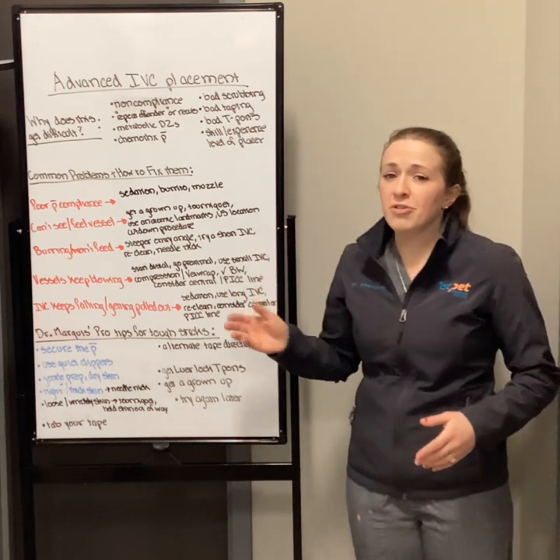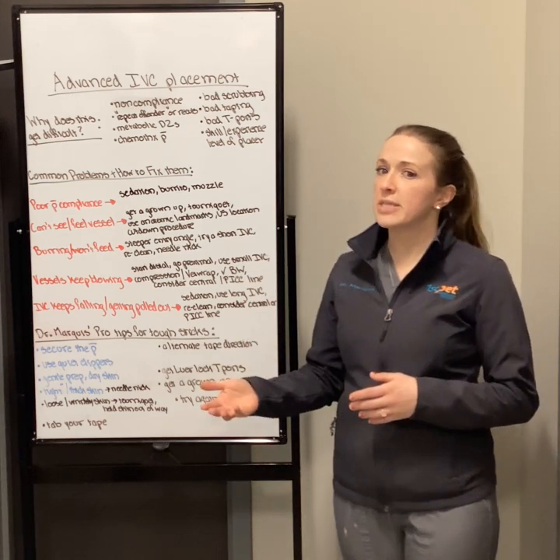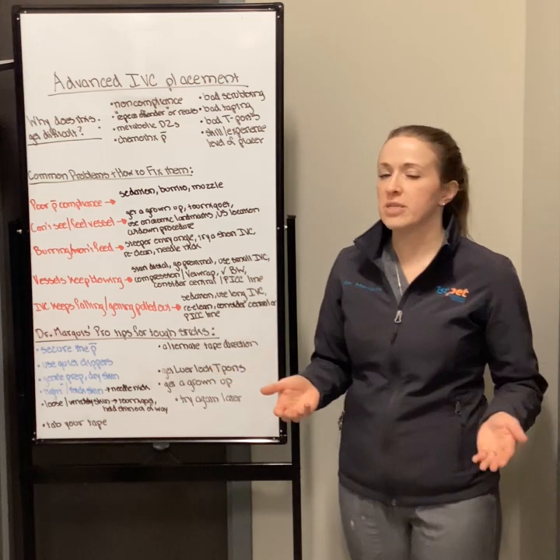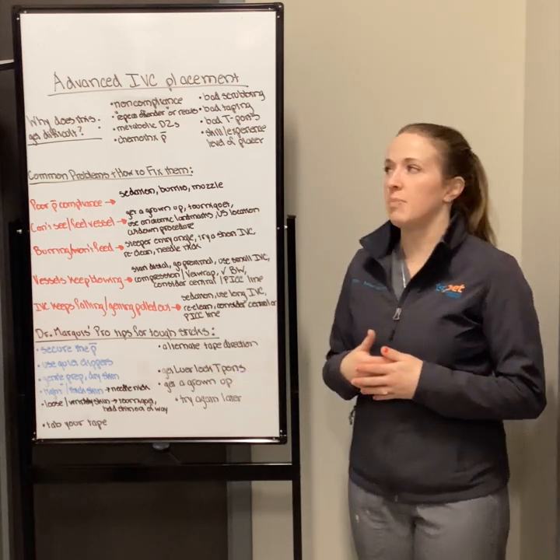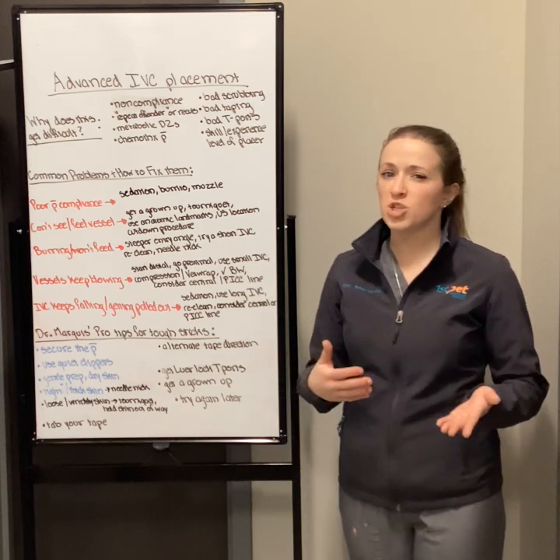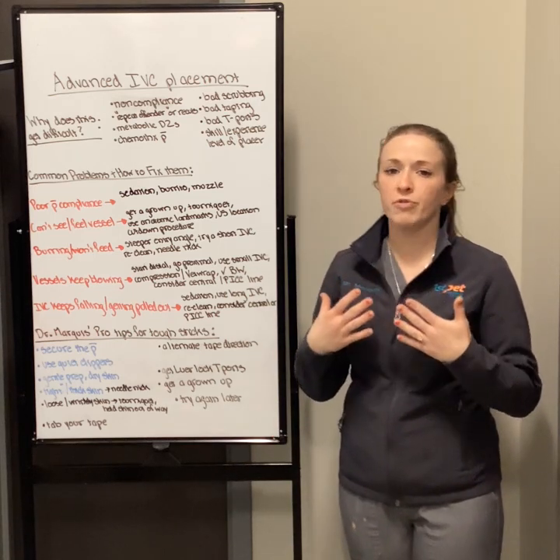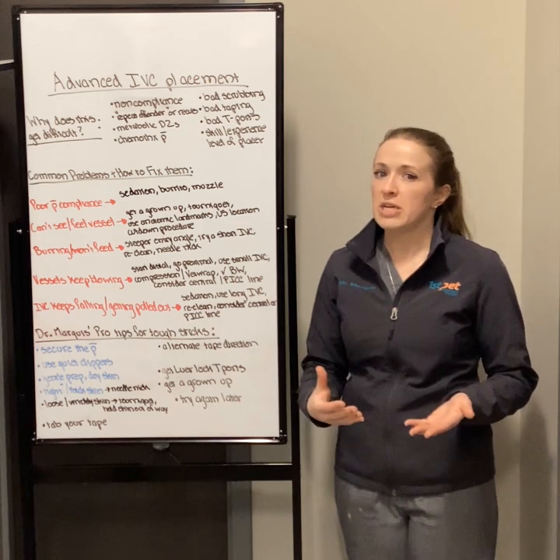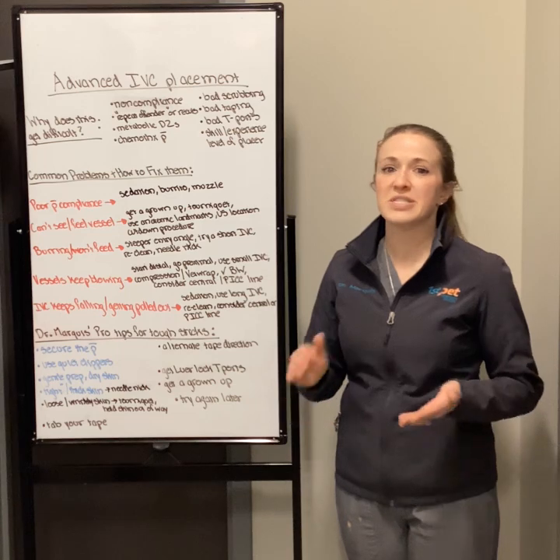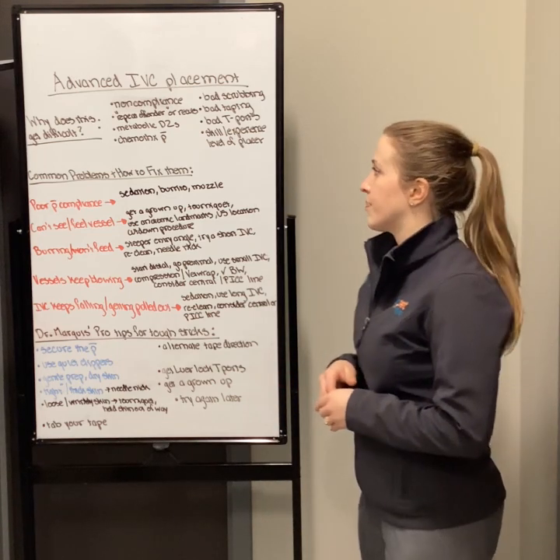A repeat offender or a recut. This is an animal that's been hospitalized recently or has just been sent home. It had surgery somewhere else. Maybe it came to you for a second opinion. These animals have usually had multiple IV catheters, maybe central lines. Maybe some of their tissue is scarred or they have bruising or phlebitis. These guys can be really tricky to find normal anatomy, normal vessels, and then let alone for the vessels to stay patent and stay healthy during their time in the hospital.